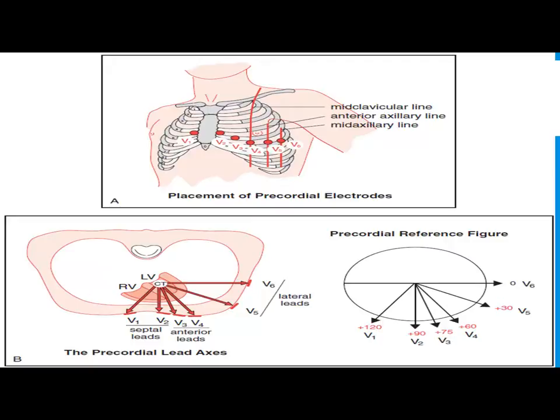That is not the way that you do it. As you see here, you've got your V1 to the right of your sternum, and your V2 to the left of your sternum. Then you place V4 after V2, and then you find V3 right in between that. Then you move on around.